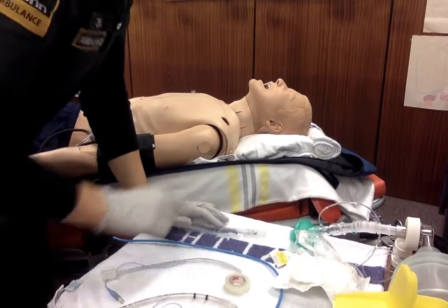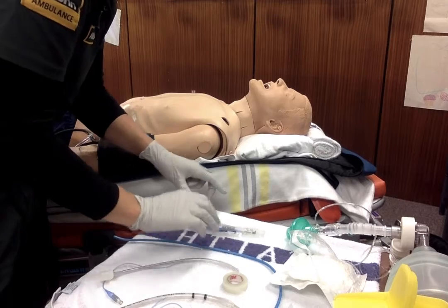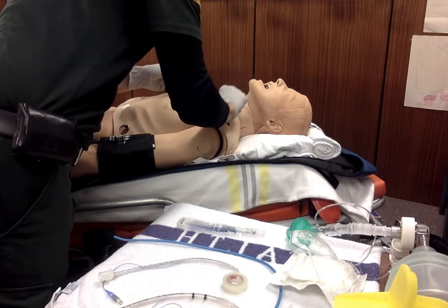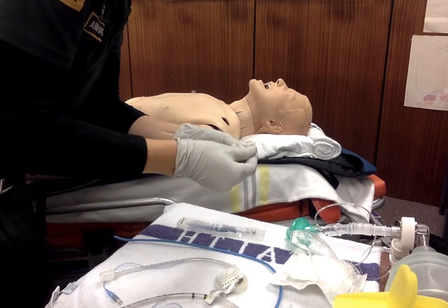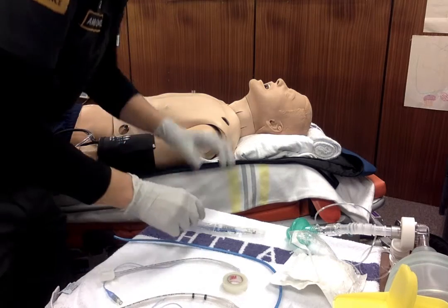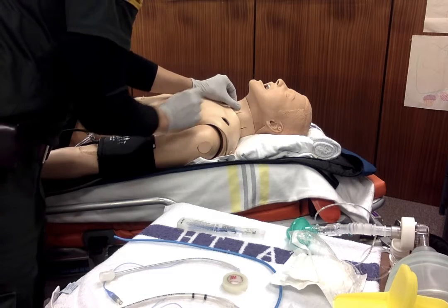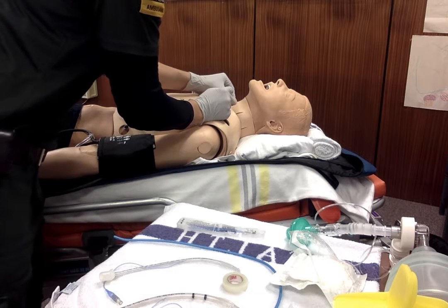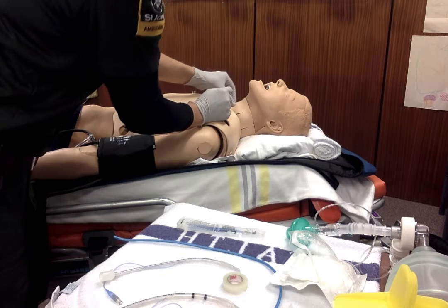Once you've gone through that and you've decided you're going to go ahead, you want to try and keep everything as sterile as you can. So we've got it here on a nice sterile sheet. We're going to clean the area with whatever we've got. And we've got hopefully sterile gloves, otherwise give things a bit of a clean. So we're going to palpate, looking for the laryngeal prominences, the laryngeal horns, and then between that with a thumb, feeling for where the cricothyroid membrane is. In the male, it's in between, where the Adam's apple is, just below the greatest prominence.